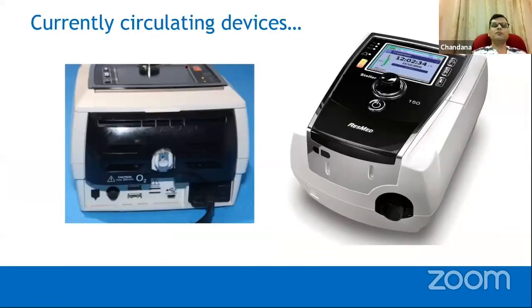So currently circulating devices, these are the devices. You have a low flow oxygen that you can connect to this one, and it generally mixes. This is the issue. It mixes the room air.